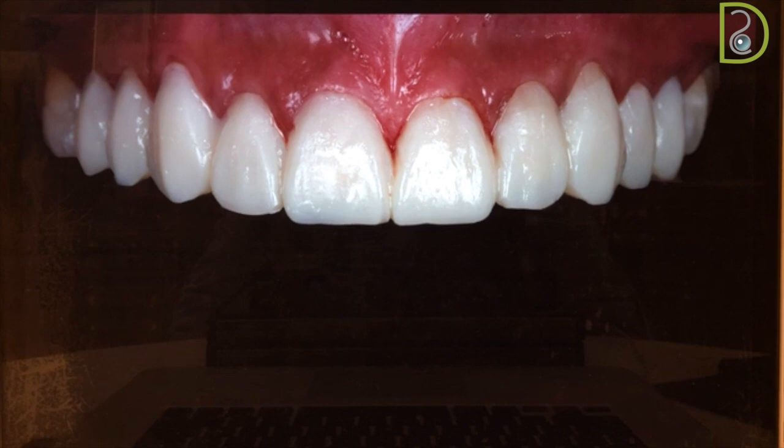Now we can use the locked technique. Locked, you're just going to keep it there. You'll place your putty, remove it and keep it locked, but all you need to do is just cut the excess with the bur, leave it stuck in the proximal areas and a little bit on the palatal surface. Now, of course, if you're going to do that technique, which I really don't recommend most of the time, all you need to do is to polish it, make sure it's not interfering with the patient's occlusion, especially when we use it in the upper arch, and double check your excursive movements as well.